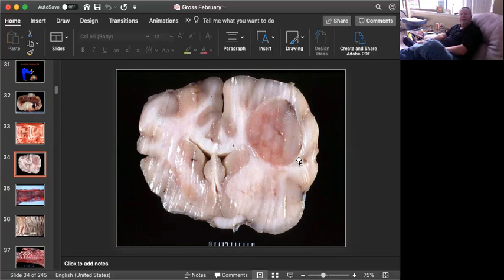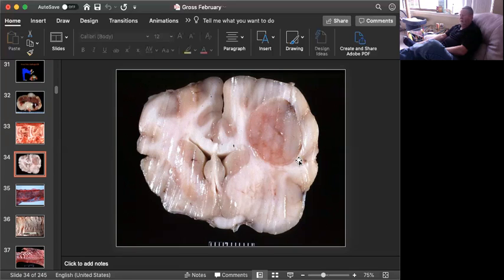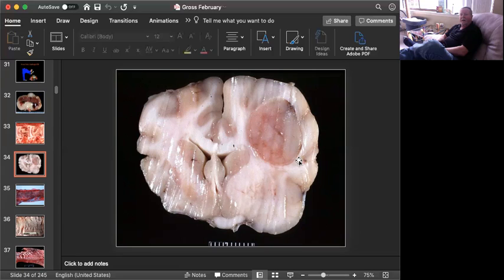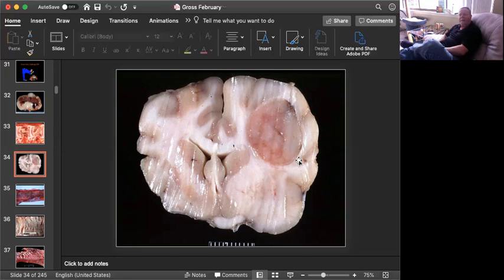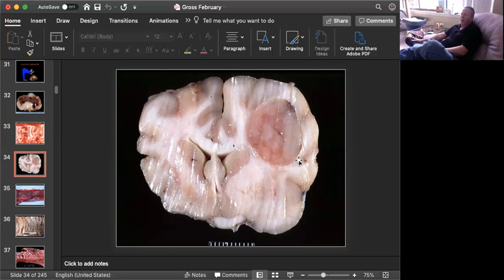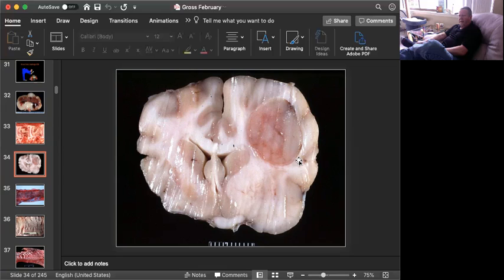But the other thing about this neoplasm I want you to look at is it has a relatively gelatinous appearance. Now, this is characteristic of low-grade oligodendrogliomas. These are tumors of oligodendrocytes. They make myelin, and so they have a lot of this gooey myelin-like appearance. The cells are surrounded by this material. Characteristically, these have been called chicken wire-looking tumors under the microscope. So they have a characteristic appearance.